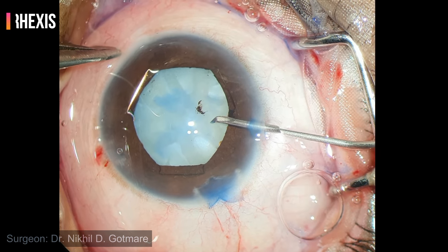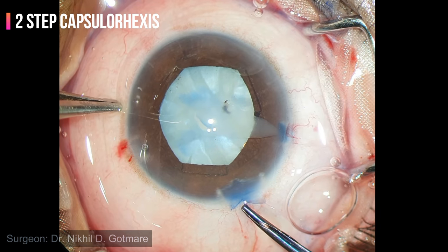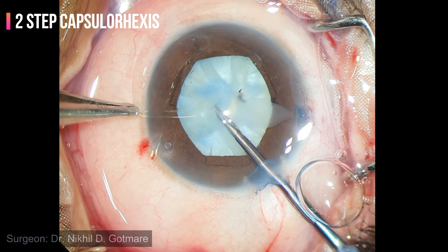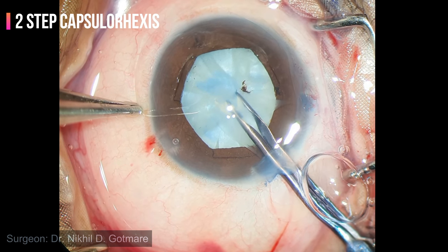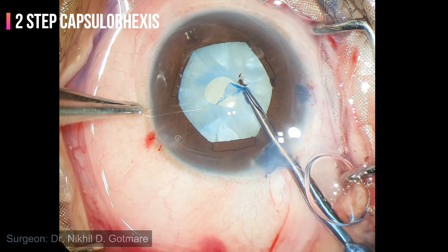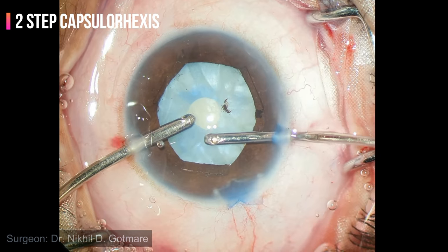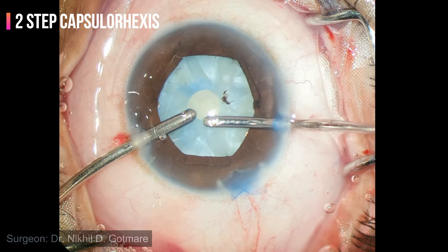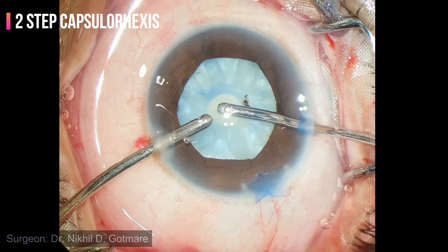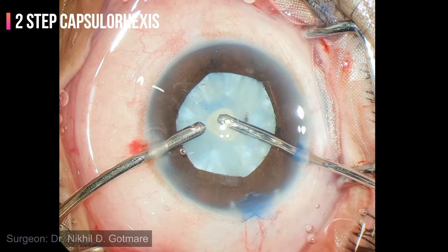I am planning to do a two-step capsulorhexis in this case. The rhexis is initiated using a cystitome — you can see the milky fluid coming out. A small rhexis is first made using capsulorhexis forceps. Now I am using bimanuals to aspirate the milky fluid and decompress the bag. All the loose swollen cortex is removed by milking.